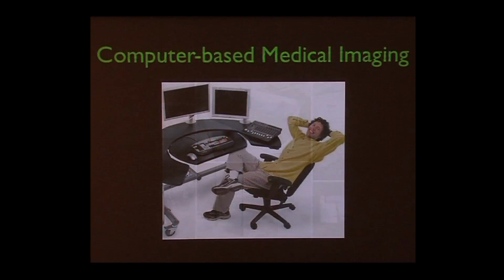And then part of the development was that it all became digital. In the last 13 years here or more, I haven't seen a single film unless somebody brings it in for me to look at. If somebody brings in a film, we can digitize it and make it available for comparison to the digital images that we have. So a chest X-ray is all digital. Everything is on a computer. And we'll talk about that.